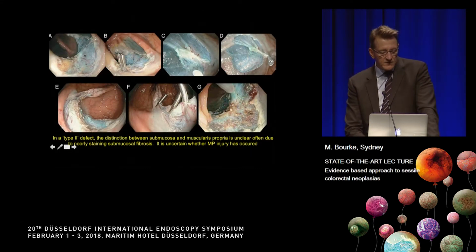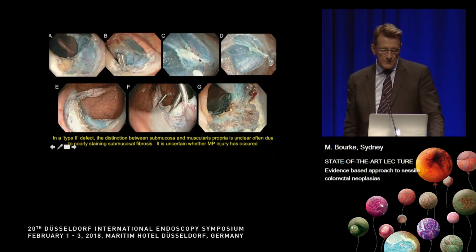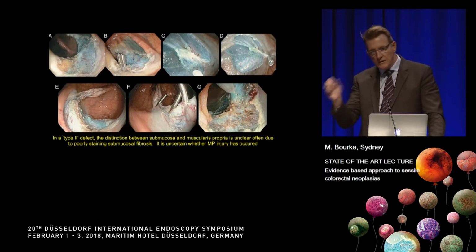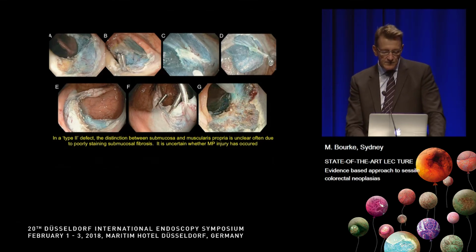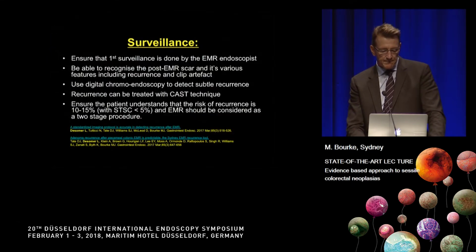And then this other one is the type 2 DMI, which is the submucosal fibrosis. We can't be sure that there isn't some injury to the muscle layer in all of these examples because the muscle is adherent to the submucosa. Maybe it's injured with diathermy or in some way. And so it's best to focally close that aspect of the defect as I demonstrate here.